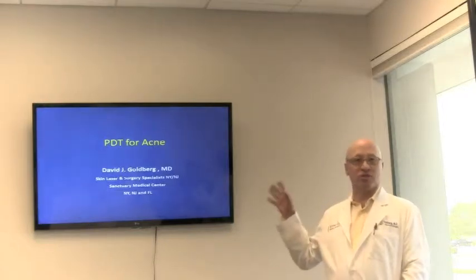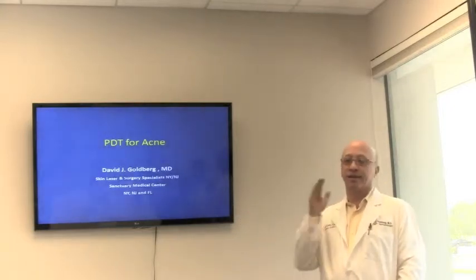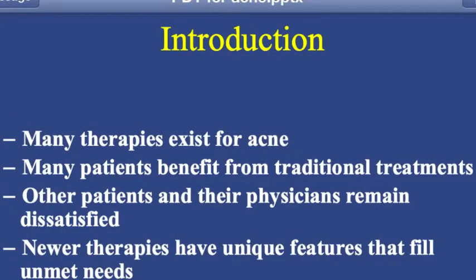This actually is part of a much larger talk that I have given before on PDT for lots of different things. And obviously, photodynamic therapy in a dermatology office is most commonly used to treat precancerous changes of the skin. So, some of the stuff that's obvious.